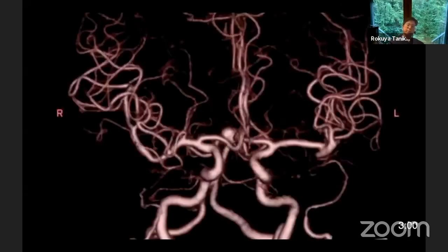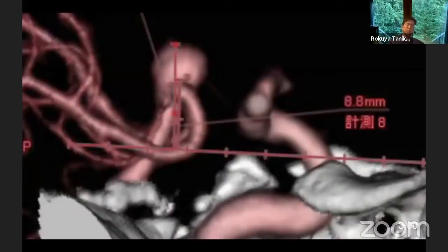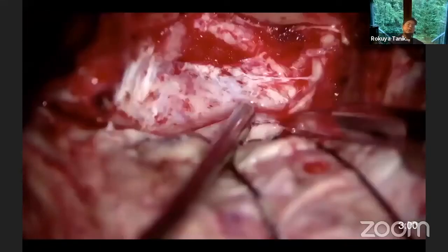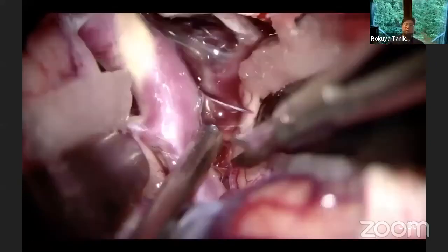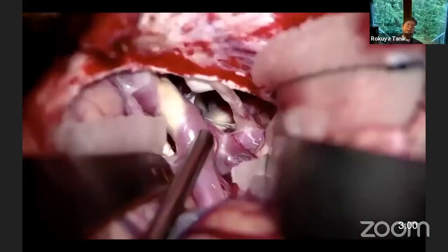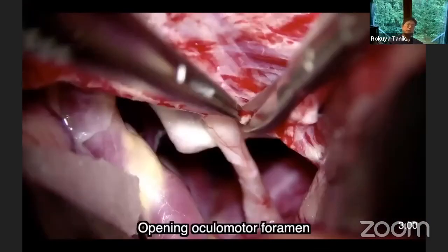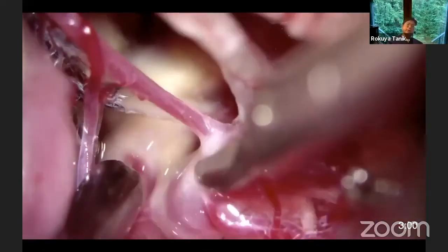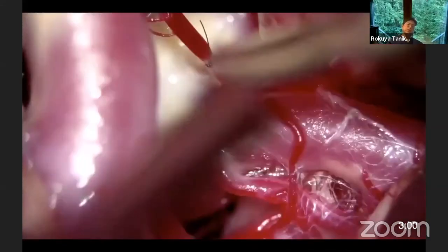This is a 72-year-old female with a basilar aneurysm — the right-side dome recognized on CT angiography. I performed an epidural trans-cavernous approach by exposing CN3, CN4, and V1. In the subdural space, I retracted the temporal lobe and secured the lateral cavernous space. The aneurysm was exposed. The right posterior temporal vein is stretched, attaching to the dome. The cavernous segment of the oculomotor nerve is freed. The tentorial edge should be cut in this case to prevent injury during manipulation of the aneurysm.